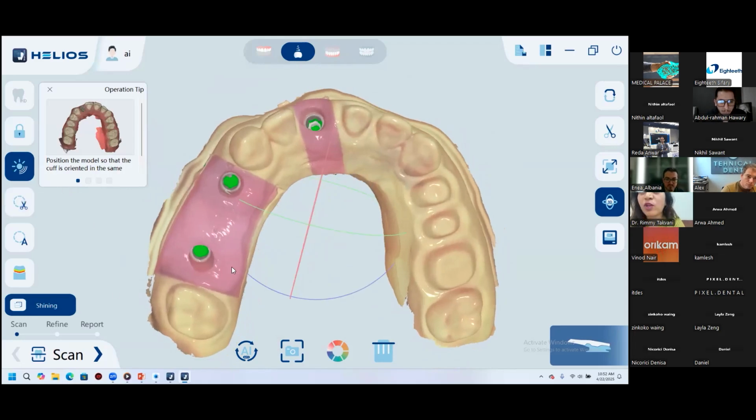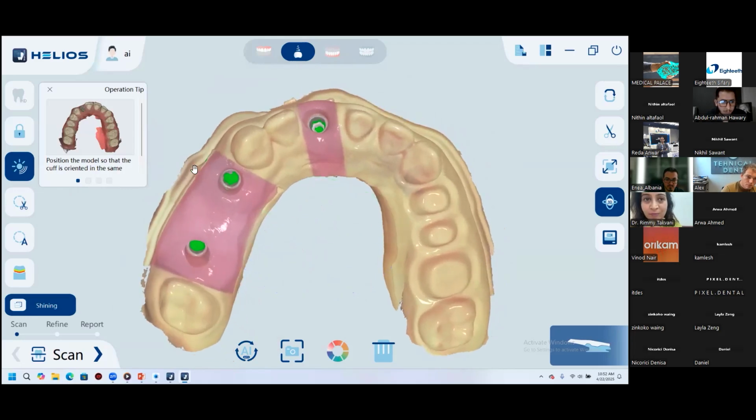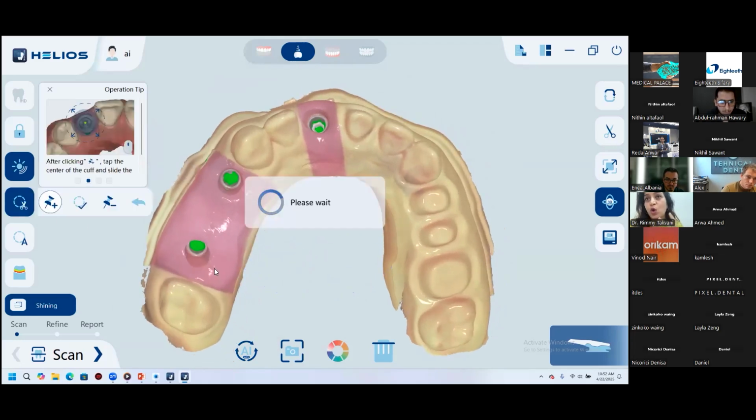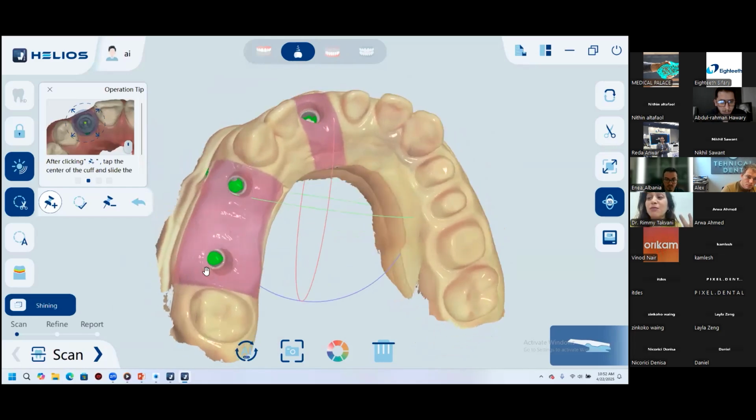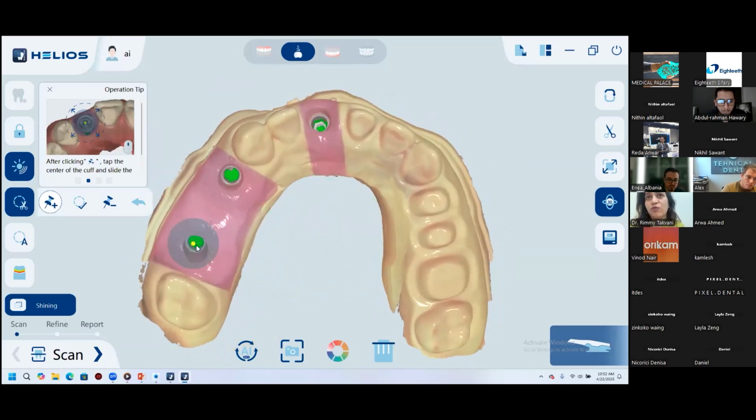Dr. Vinod, when you talk about FPS, first of all, you cannot compare. You have to know two things. There are two types of frames per second. One type of scanner records images frame per second. The number with those scanners, if you compare with Trios or Trios 3, will always be higher, ranging close to 300 to 350 frames per second.